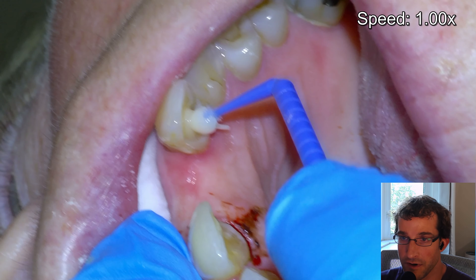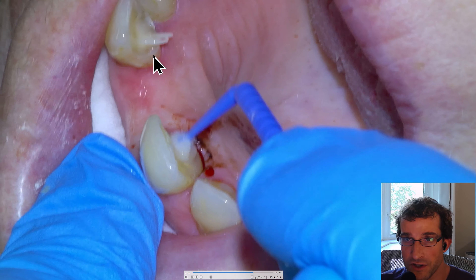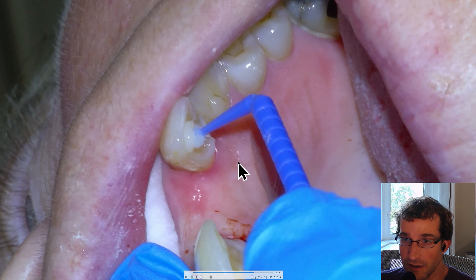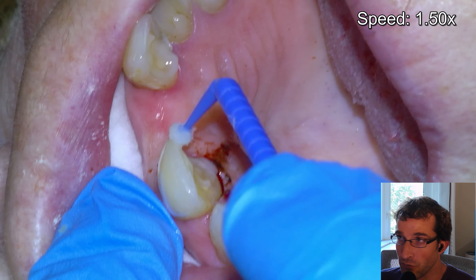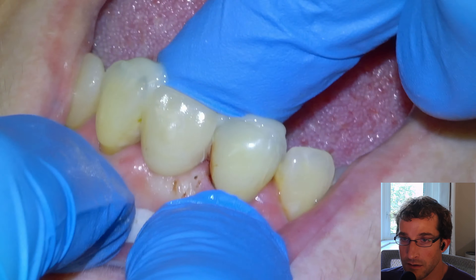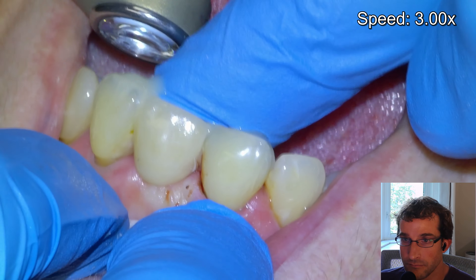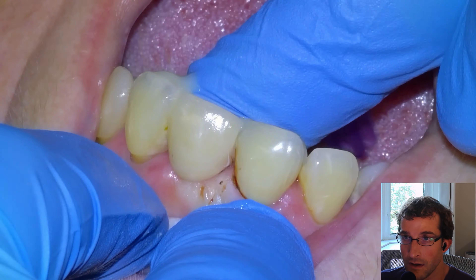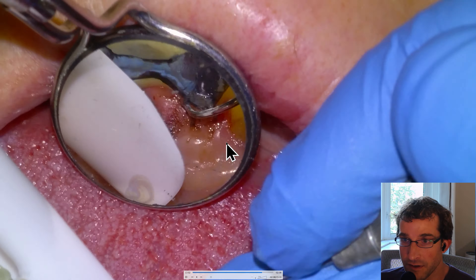We'll use a tooth primer for the surface of the tooth, scrub it in, and air dry. For these cases I actually like to put a little bit of the resin cement on a micro brush and dab it into the prep so that it gets into all the nooks and crannies and the little indexing pothole that we make. Then we'll load up the unit and squish it in. That's going to get light cured. Then we'll clear up the cement and that's going to be it for this case.